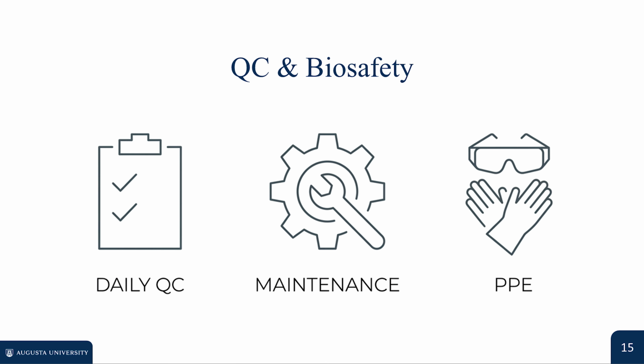Multi-level commercial controls spanning low, normal, and high concentrations must be evaluated using Westgard rules, holding patient testing if values exceed 2 standard deviations. Scheduled maintenance, including weekly deproteinization and monthly aperture flushes, prevents protein buildup and aperture clogs. Pre-analytically, EDTA specimens must be mixed for 2 minutes and inspected for microclots using applicator sticks, rejecting clotted specimens immediately. Finally, all laboratory personnel must follow universal precautions, wearing gloves, lab coats, and splash protection when handling biological specimens and hazardous waste.